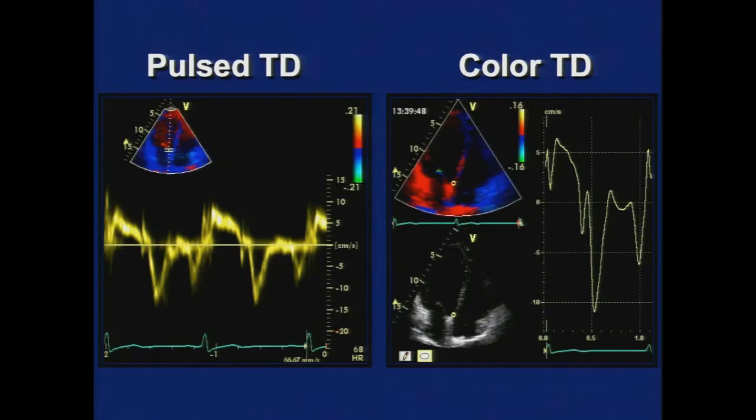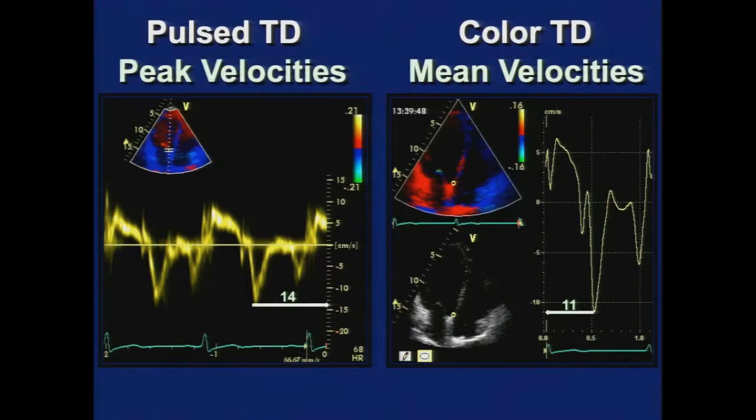Now, as we get started, we have to realize that there are different methods with which to obtain a derived parameter, say such as the E prime velocity. We can obtain this using pulse wave tissue Doppler, as we heard earlier this morning already, or we can put the sample volume here and use color tissue Doppler. And in both instances, we can see here the S prime and the E prime and the A prime velocity. But remember that pulse wave Doppler measures the peak velocities, and color Doppler, of course, measures the mean velocities. So the values that you obtain with pulse wave Doppler are going to be higher than those that are obtained with color Doppler.